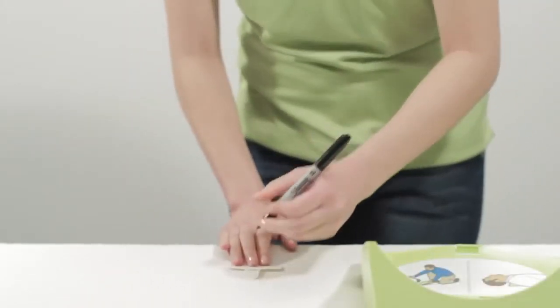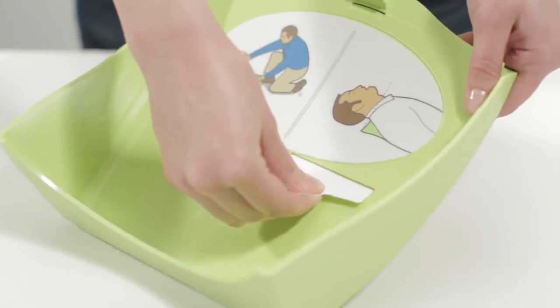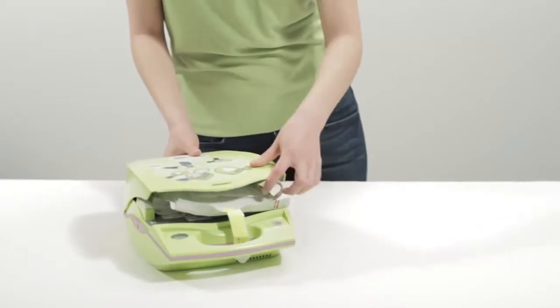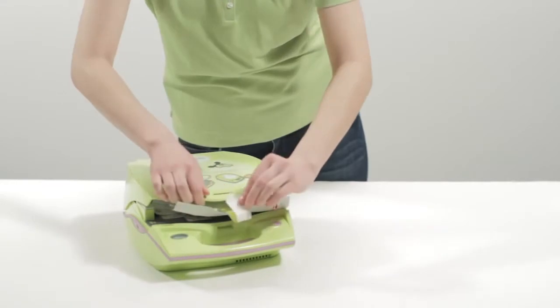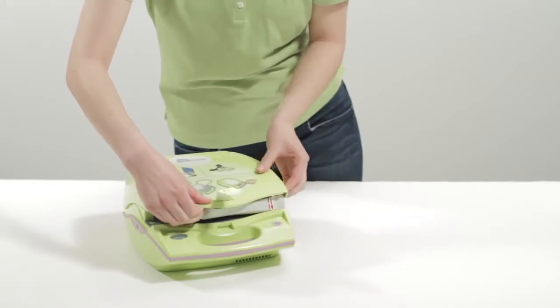Write your emergency number on it, then reinsert it in the slot. The emergency number is now visible on the lid. Now put the lid over the CPRD pads package by anchoring it in the rear, and then thread the expiration date tab through the slot in the lid so it sticks through completely.